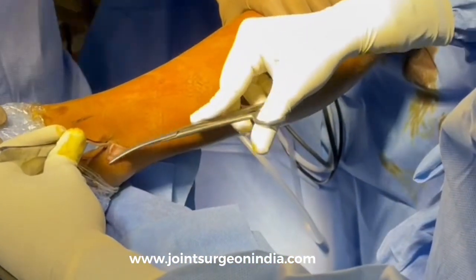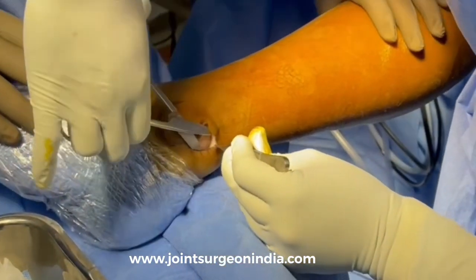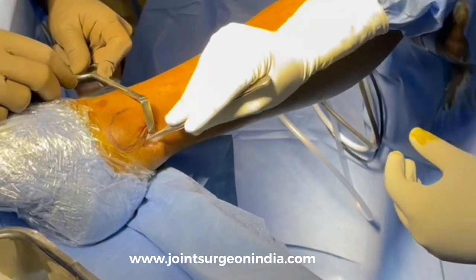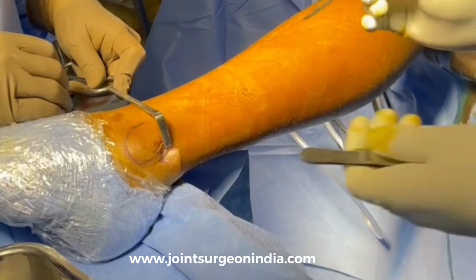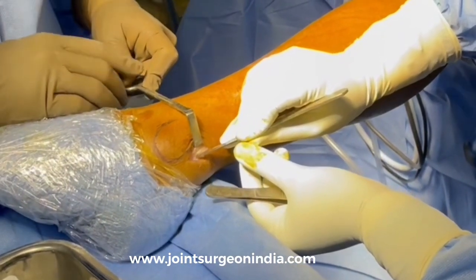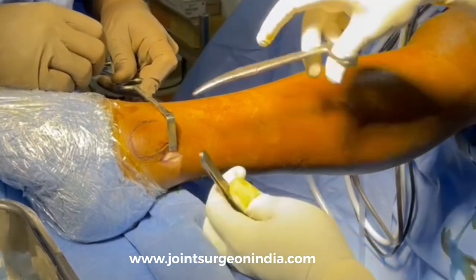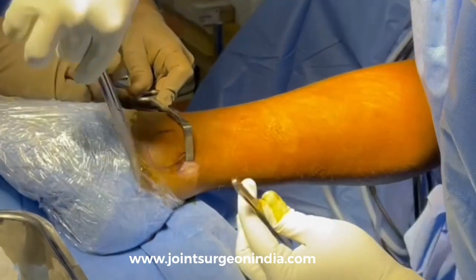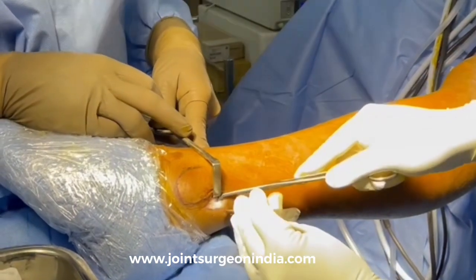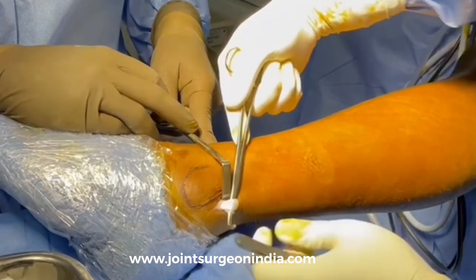Just underneath the skin and subcutaneous tissue, you can actually see both tendons — the Peroneus longus as well as the Peroneus brevis — covered by their fascia. Carefully dissect the fascia overlying the tendons. Once the fascia is released, you can easily identify the Peroneus longus tendon using mosquito forceps by passing it behind the tendon and then pulling it.